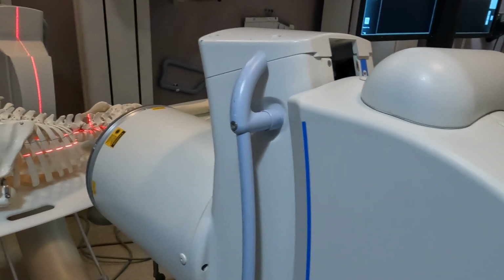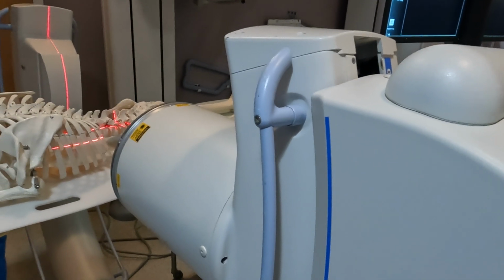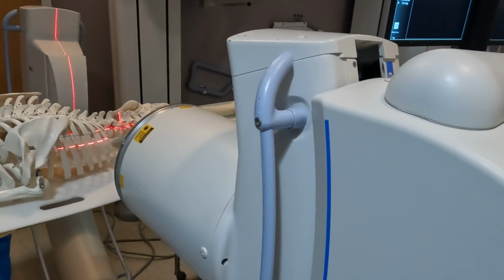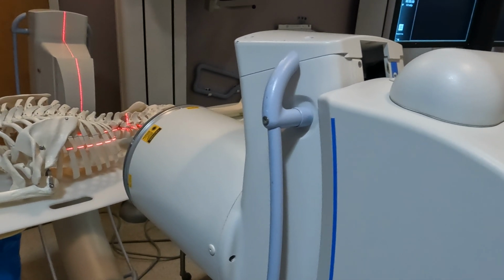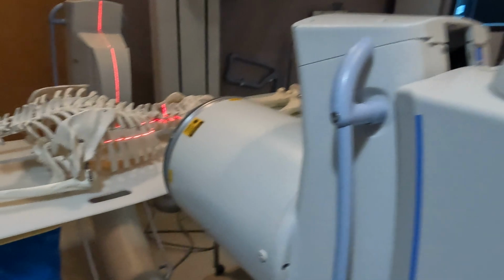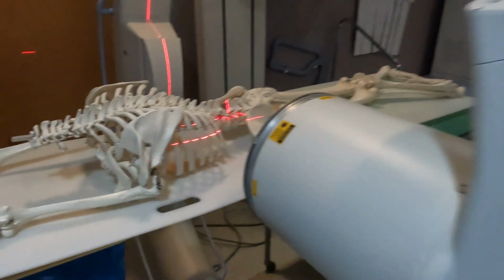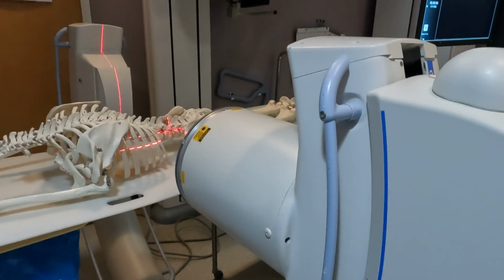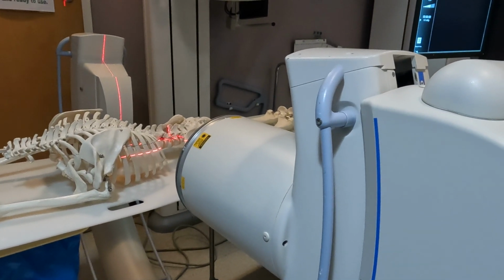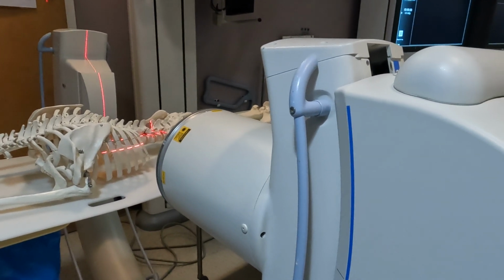To get a lateral. For the sake of the video, I didn't take any x-rays, but you would take an AP and lateral image just to make sure that that works and that you're in a good spot. Here I can see that I am exactly on the spine because it's not a real body. So now that I know that I can make it all the way around the body without hitting the table, I can get a good AP and a good lateral, I'm going to start my spin on the screen.